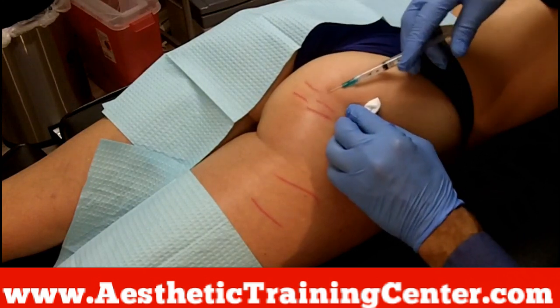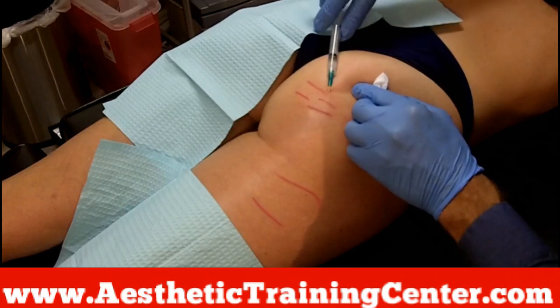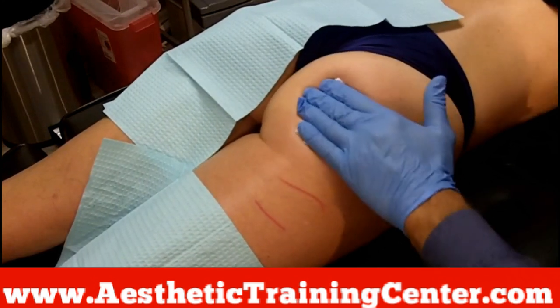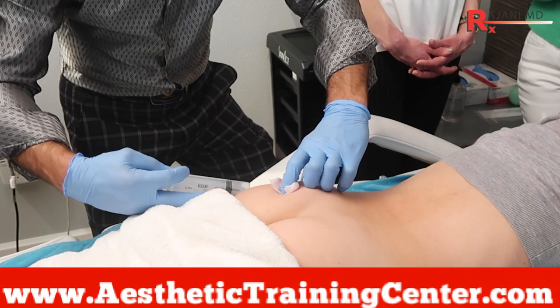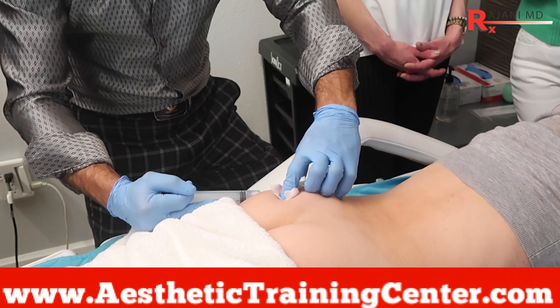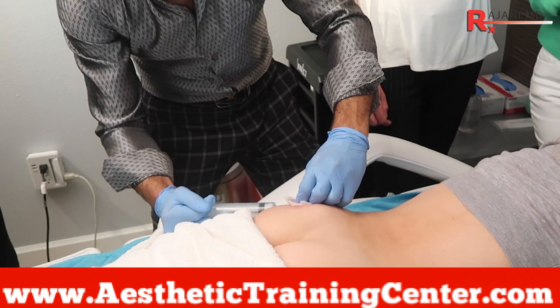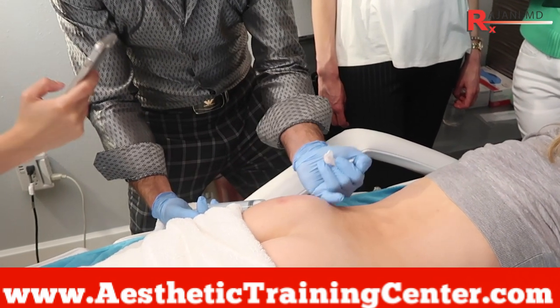Cellulite treatment is often the gateway — people start there because it's less expensive, see what Sculptra can do, and then move on to the buttock lift. We don't typically inject within six weeks of a prior session, and most patients return at three months, six months, one year, and three years, adding to the result as they see it and as finances allow. Most Sculptra buttock procedures are done in two sessions more than six weeks apart. The PLLA is long lasting — the Sculptra trials stopped at about two years, but the results maintained, indicating the product lasts well beyond two years, and we have patient data out to seven years.